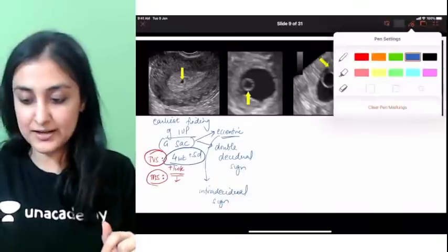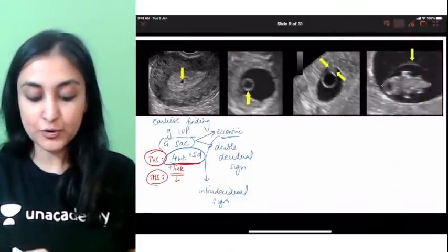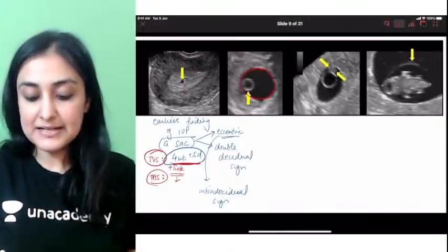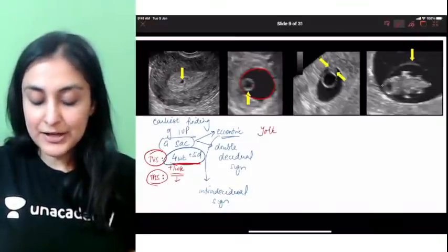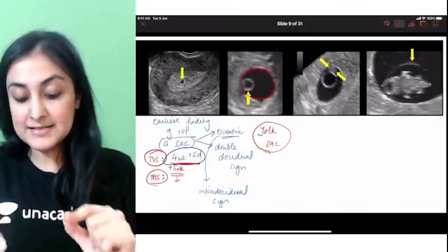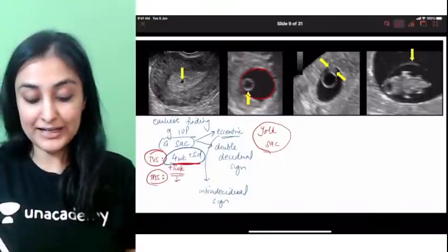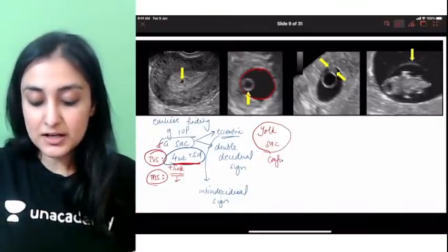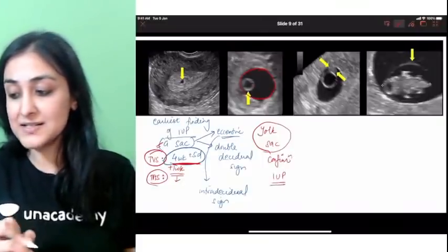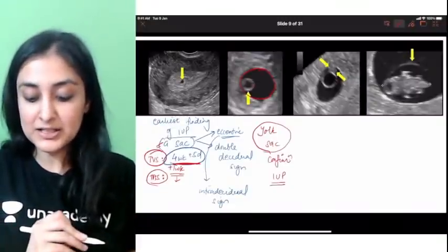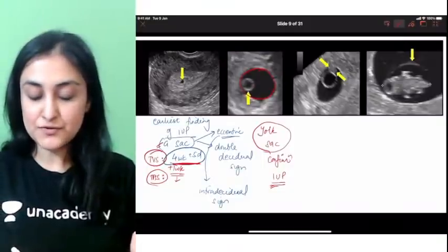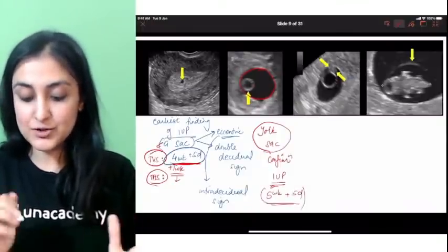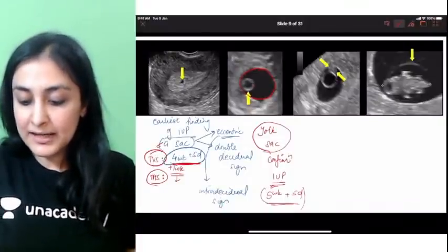At around 5 to 6 weeks on TVS, within the gestational sac a yolk sac develops. The yolk sac is the confirmatory sign of true intrauterine pregnancy — it confirms it is not a pseudo-gestational sac. This ring within the sac is the yolk sac. Slowly following this, what happens next — the embryo develops.